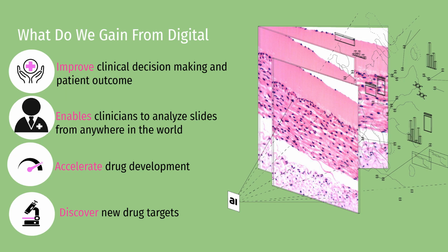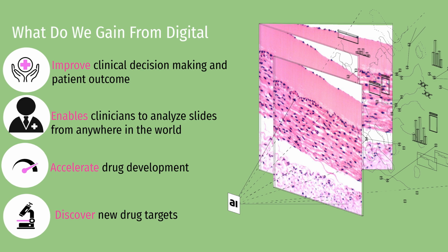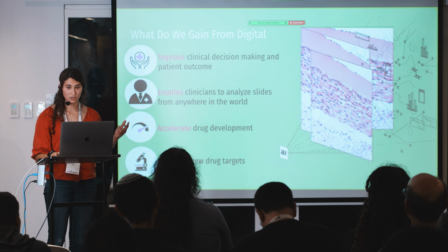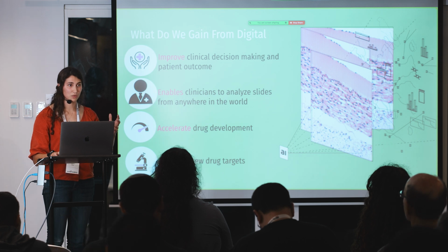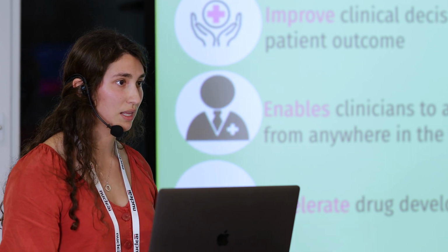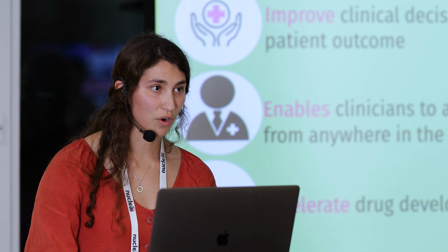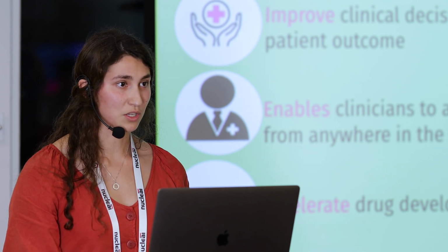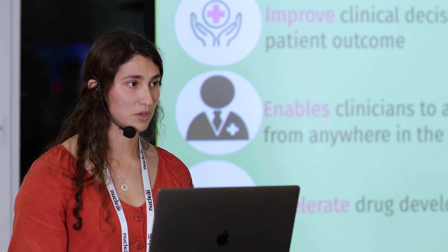But why bother? What do we gain from going digital? Pathologists could look at a biopsy and give you a qualitative analysis, perhaps saying that we see an immune response or that this patient has cancer. But they're not going to be able to tell you exactly how many immune cells we see or some more quantitative predictive factor. This is going to allow us to improve clinical decision making, which leads to better patient outcomes. Furthermore, as I mentioned before, we are now able to have our slide analyzed by pathologists anywhere in the world. This really opens up the possibility for remote medicine and lots of other opportunities in that area.